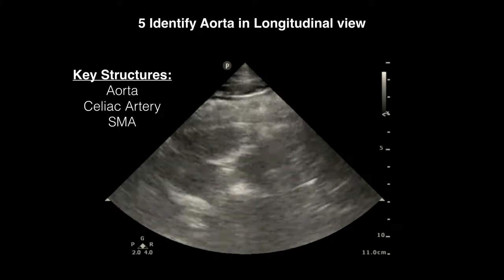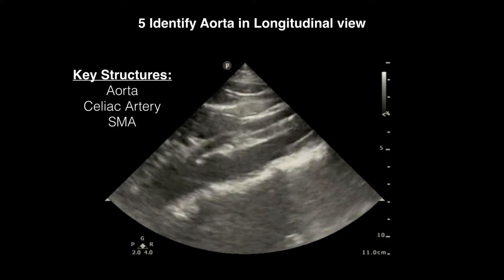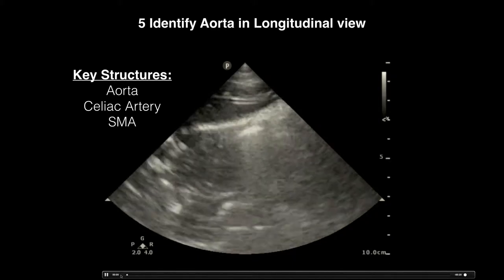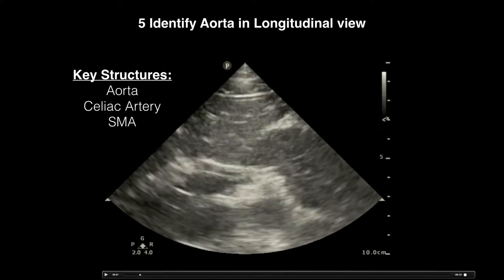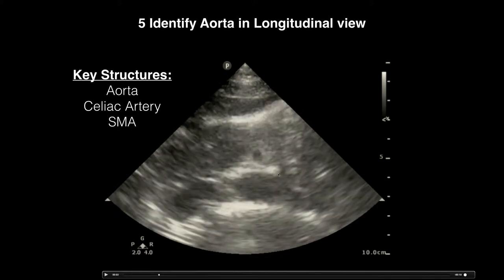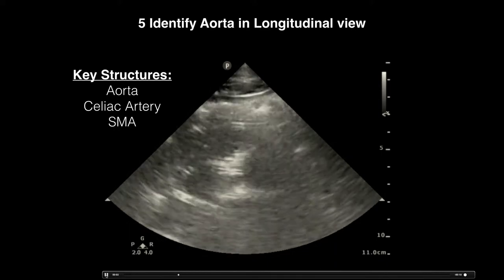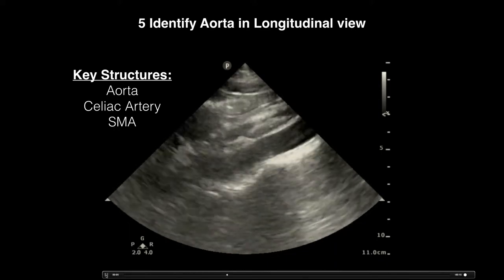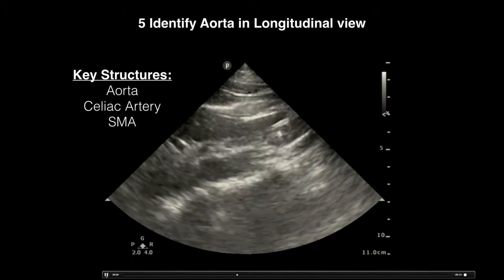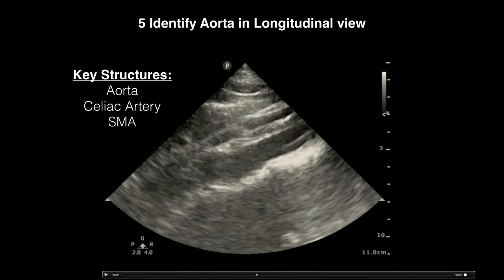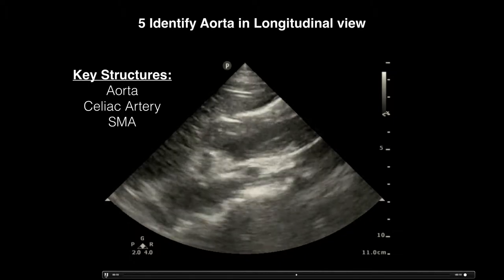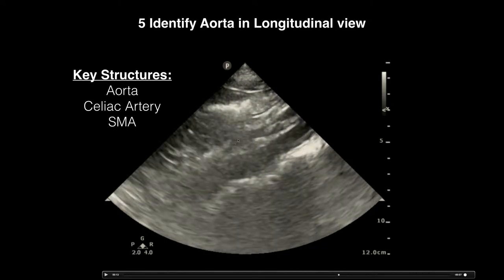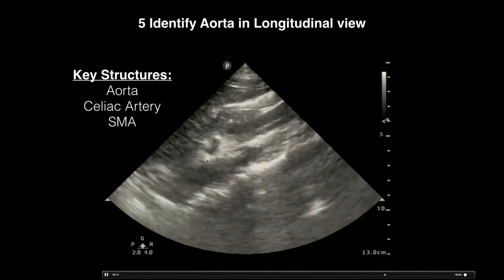The last view is the longitudinal view of the abdominal aorta. Center the aorta in the short-axis view, then turn 90 degrees clockwise to get the long axis. You can then see parts of the SMA and the celiac artery going anteriorly. Another static long-axis view shows the aorta with the SMA coming inferiorly and the celiac artery going directly anteriorly or sometimes superiorly.